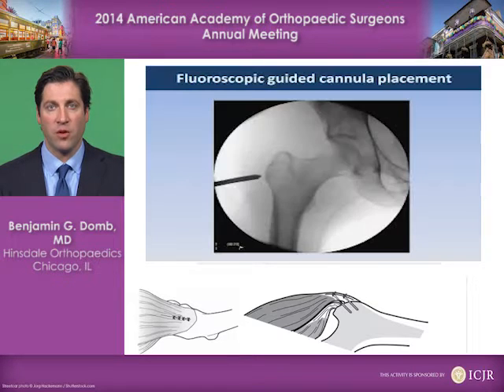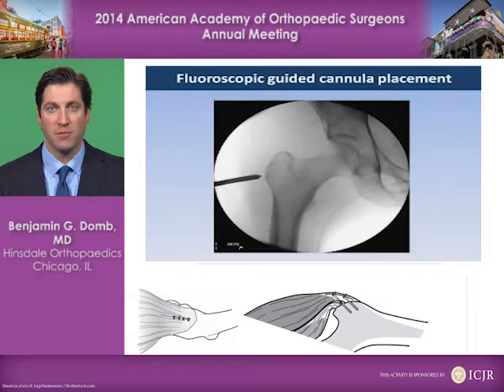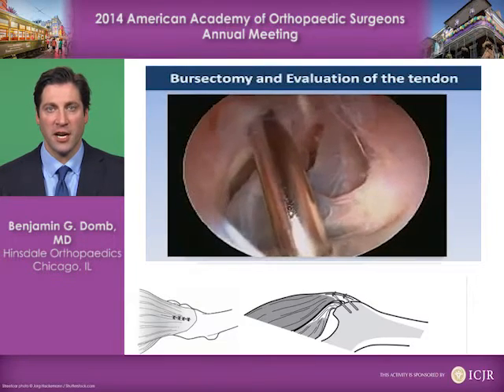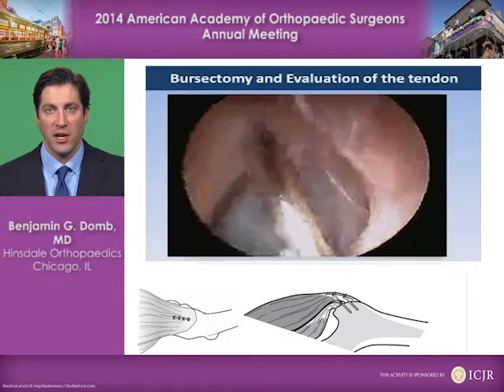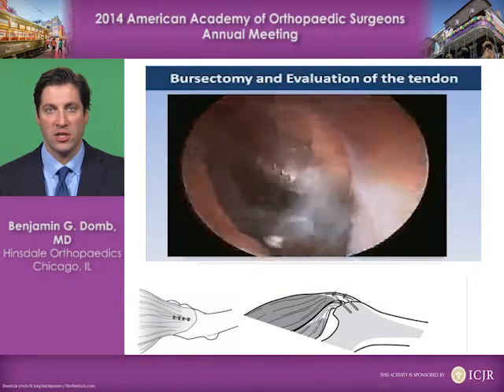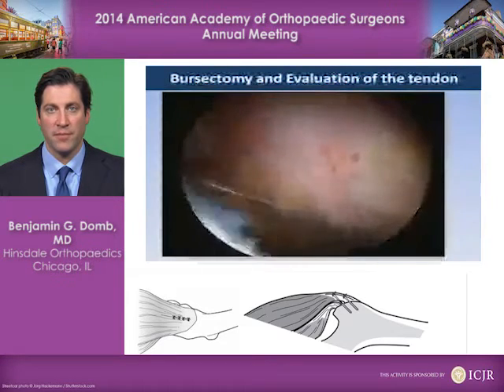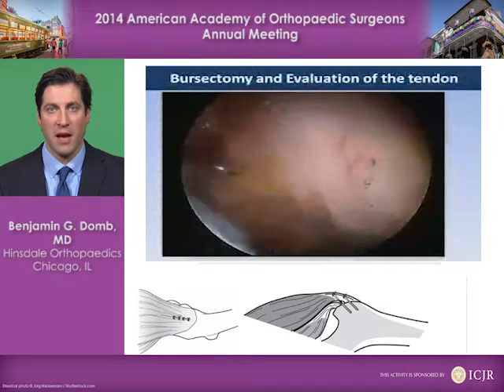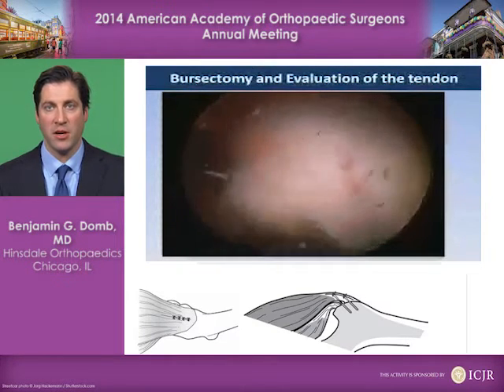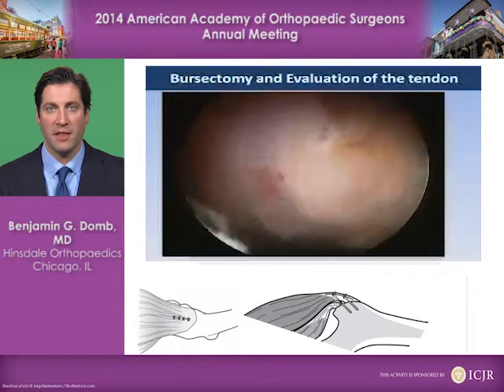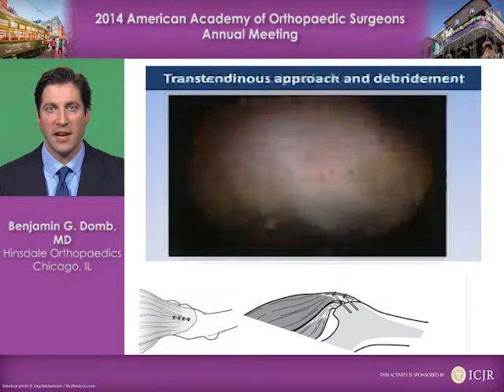We begin with fluoroscopic guidance to access the peritrochanteric space, and portals may be placed in a variety of locations around the peritrochanteric space. A trochanteric bursectomy is necessary in order to expose the tendinous insertion. Understanding the arthroscopic or endoscopic anatomy of the peritrochanteric space is important in order to elucidate the tendon insertion, which can then be probed and the deep-sided tendon tear identified.